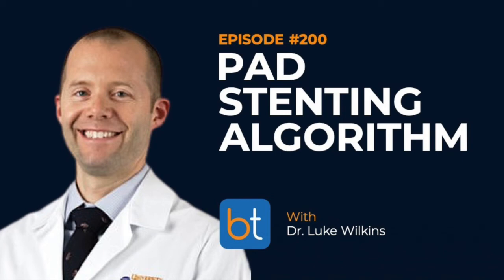We've transitioned to doing most stents as drug-eluting stents under most conditions. There are certain instances in which we'll consider alternative stent types. It is very, very infrequent that I place only a bare metal stent. And by bare metal stent, I mean a traditional nitinol stent, a non-interwoven bare metal stent. It is very infrequent that I do that. Usually it'll be a drug-eluting stent.